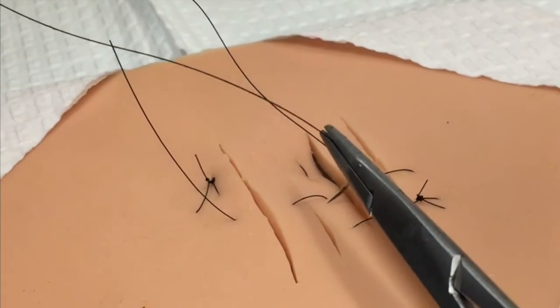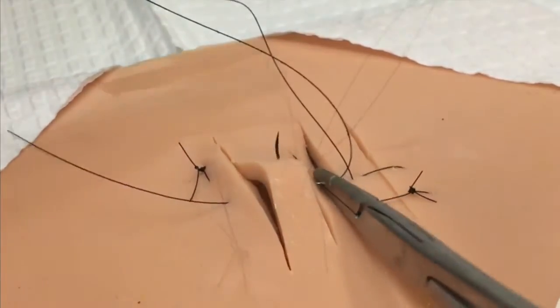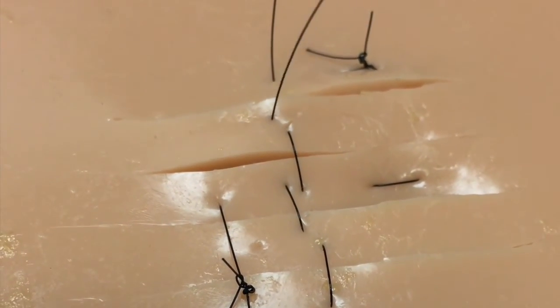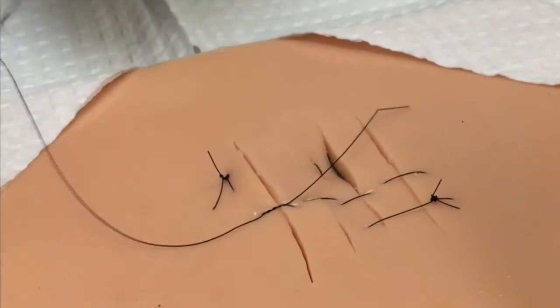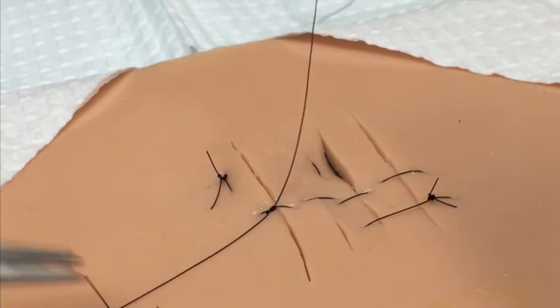One downside of using a technique like this is that it has the potential to somewhat strangulate each of the tissue islands in between, with multiple puncture sites introduced into each island of tissue. However, the strong advantage is that each of the epidermal lacerations is carefully approximated, and multiple lacerations can be closed in a series.